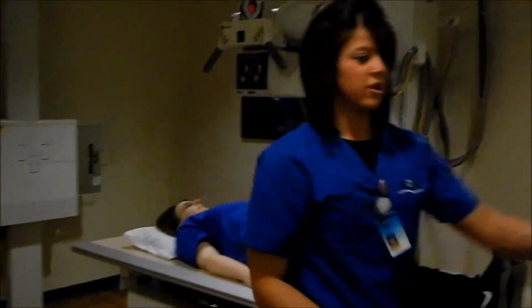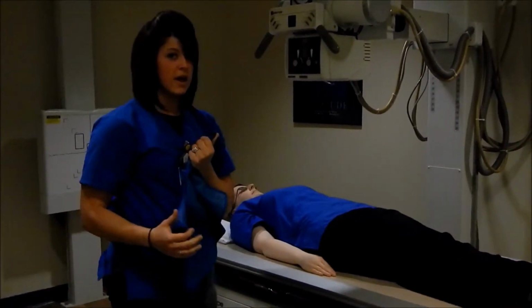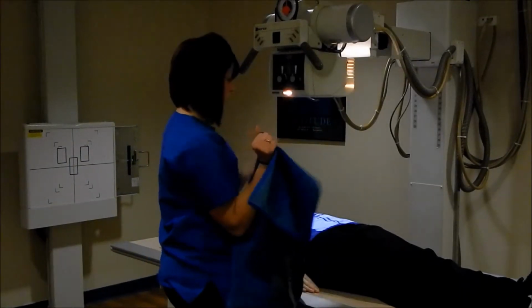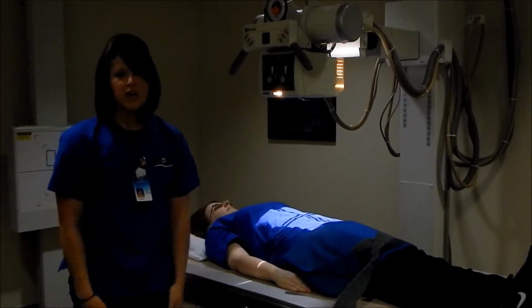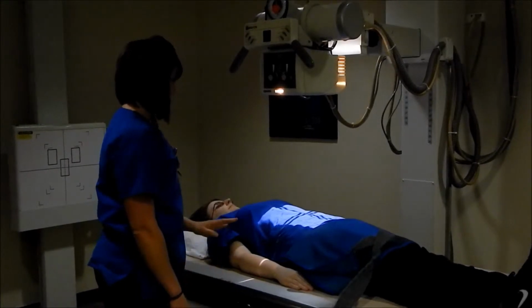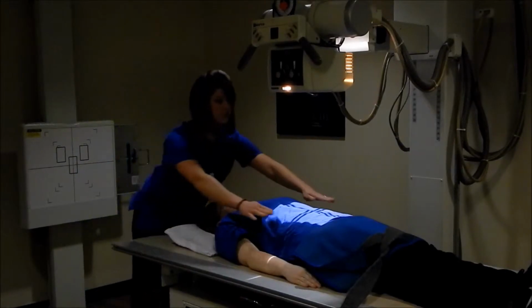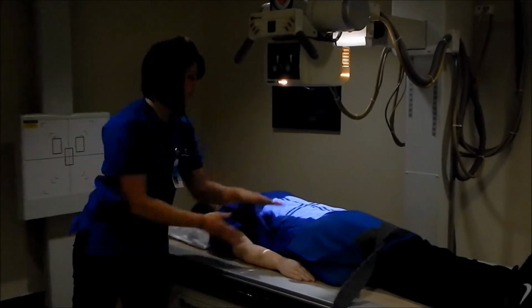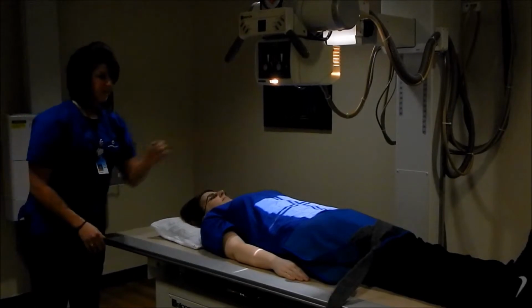The next thing I want to do is make sure I shield the patient. Because this is a female, we're not going to be able to cover the gonads because that's going to be in the exposed area. However, we can place a shield below the light, just like that, more for psychological purposes, so they feel like they're being protected. I'm going to make sure that she's not rotated any, so you can check that the ASISs are equidistant to the top of the table, and make sure that she's straight on the table so that her mid-sagittal plane is going straight down the table.